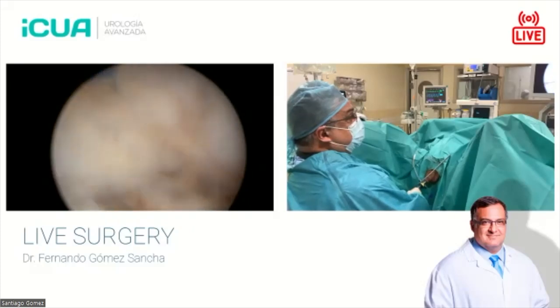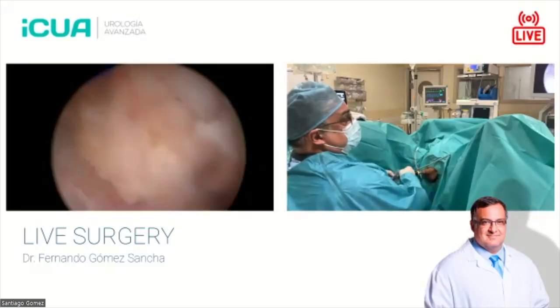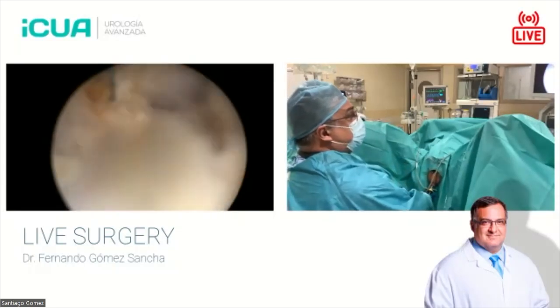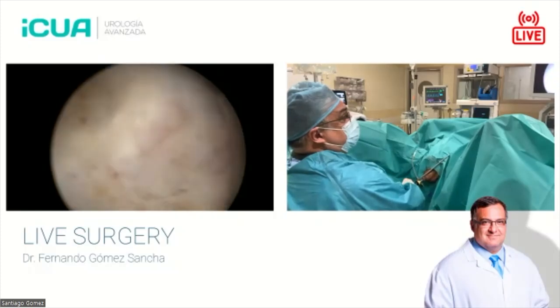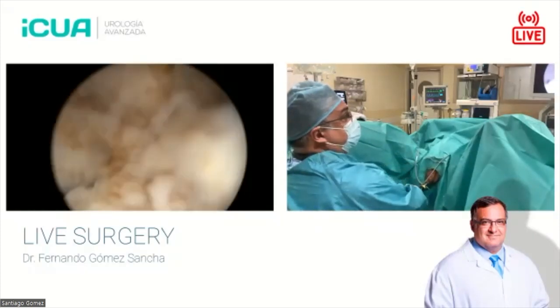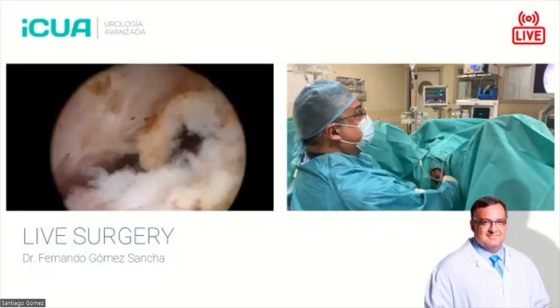Here I see that if I follow downwards, I should see, let's see where we are. This is still a little bit of adenoma. So I should construct this line until I can follow the line around the prostate. You see, the thing is that here there are some nodules anteriorly on this side, and I'm going to try to take them with the adenoma.